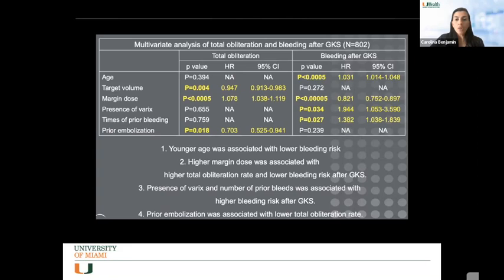Number two, all right, now you've given it enough of a dose to obliterate it over that 36-month period. What's your hemorrhage risk in that latency period, or post radiosurgery? I think that's another concerning factor, and we can control some of it, and we can't control some of it. So there is going to be a bleeding risk in that latency period, and it's important to counsel patients about that. And then finally, what are going to be the adverse radiation effects?